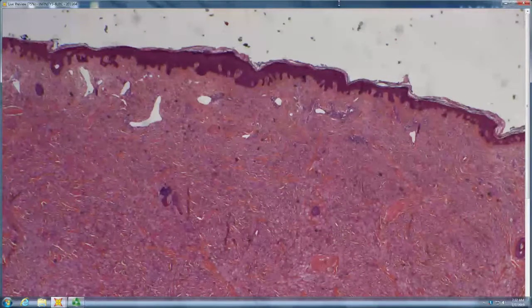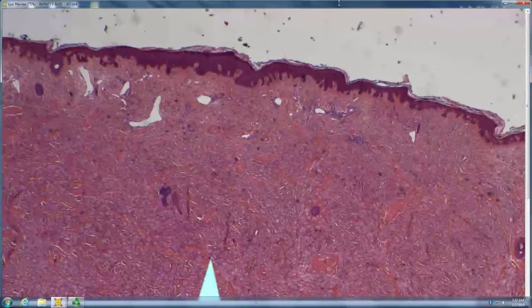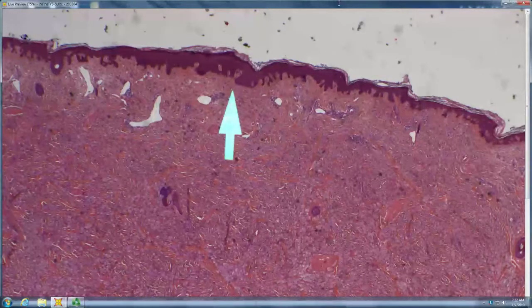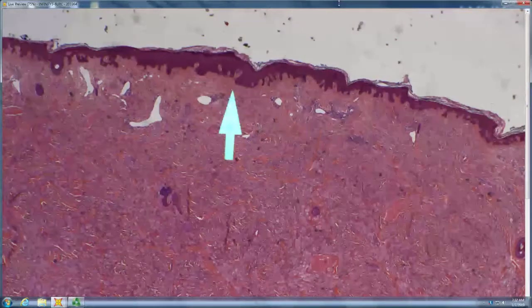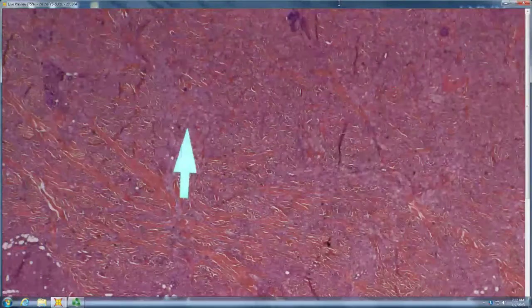So, 3. Big clue is having a tumor. A tumor will normally stretch the epidermis, thin it, efface it. 3 break that rule and have acanthosis instead: dermatofibroma, Spitz nevus, granular cell tumor. What's in the dermis is about the color of an arrector pili muscle. That would mean it's a GCT.